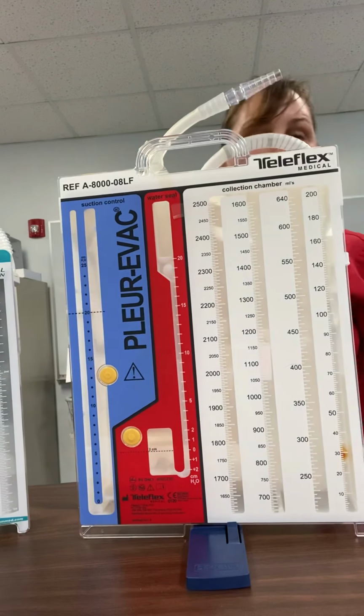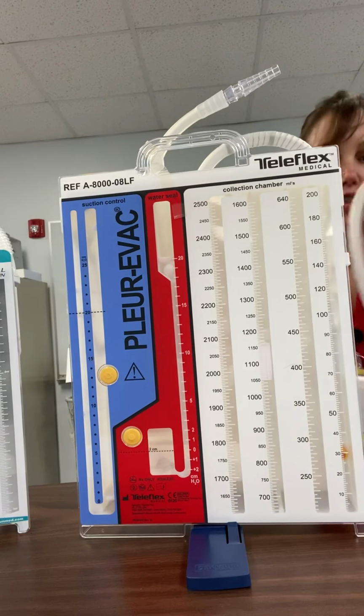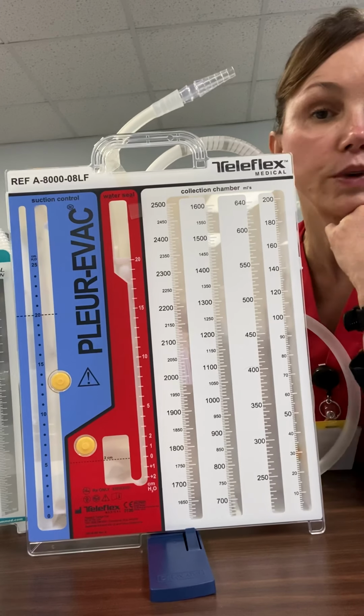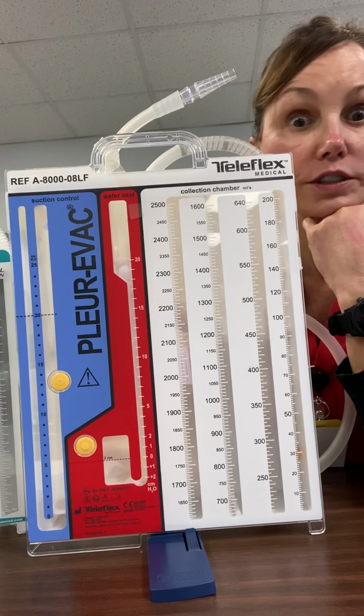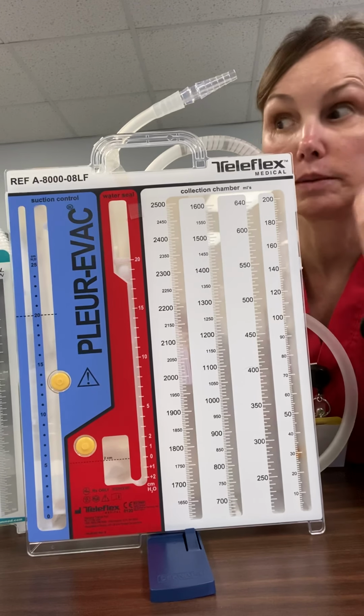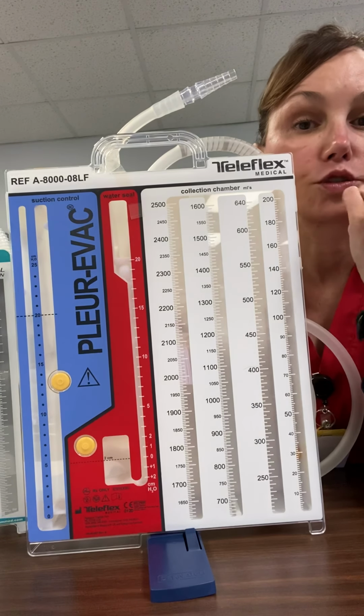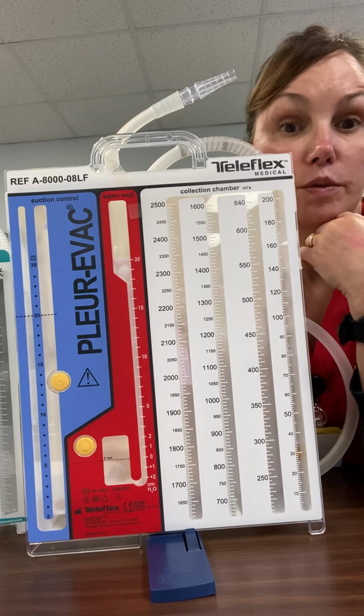I am going to show you the Pleurovac closed drainage system. Now this is a wet closed drainage system, what we call a wet system. Okay, I told you not to worry about the difference between wet and dry. I'm going to show you the difference in just 1 minute. So this is based on those 3 principles I talked about in another video.